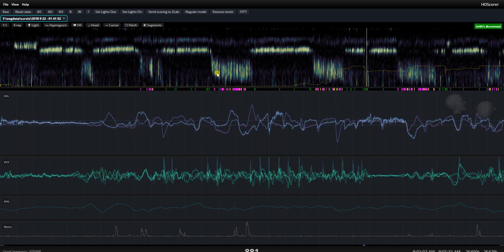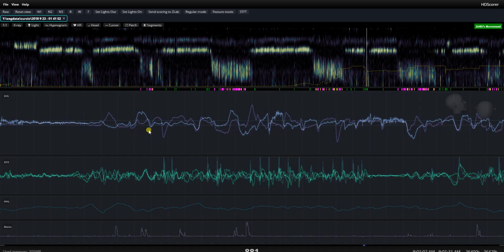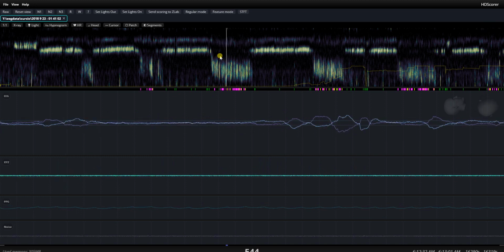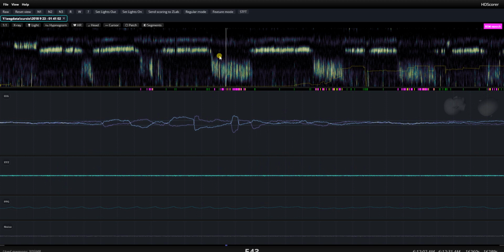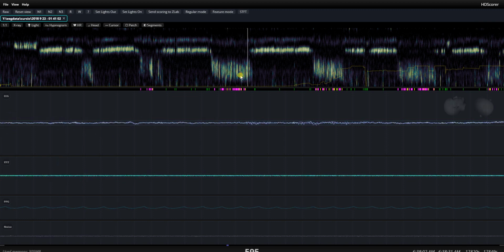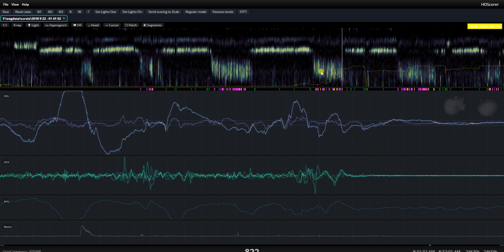But now in yellow, we have an overlap between both having a movement and also being in the proximity. Of course, that is defined in code, and I define it as being within 5 minutes. But all the movements that are within 5 minutes of a preceding REM epoch are in yellow. So these are periods in which not only are you dreaming, but you're also having an arousal during a period of REM sleep. Now, if you look at the distribution of these yellow things, they normally occur far before the subsequent onset of, again, N2 sleep. This one being the only possible exception. All the other yellows are really sandwiched in between other REM epochs.